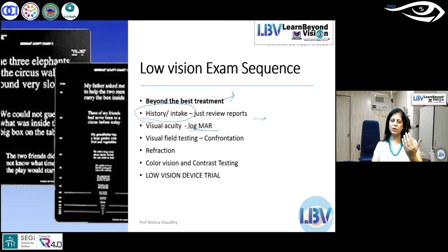You need to bring it closer. You need at 1 meter, 2 meters. And look at the thrill this patient is going to have when you do it at that 2 meter, 3 meter, because for the first time they could start reading those few alphabets, which they never could, or they guess the top alphabet.